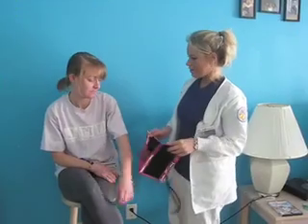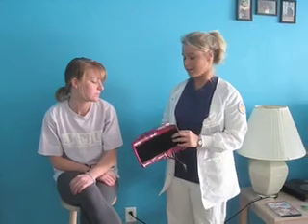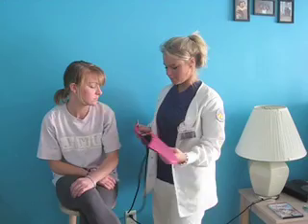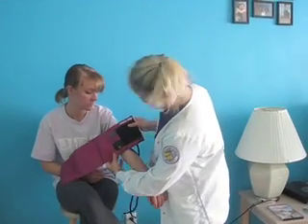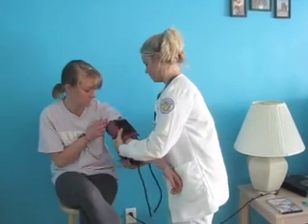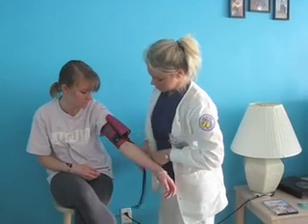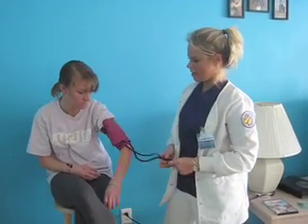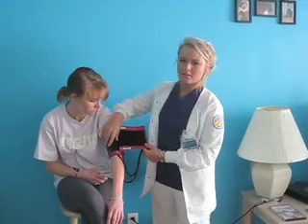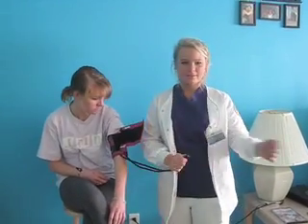Blood pressure. Hi, I'm here to take your blood pressure. Now before I take it, I just want to explain that it's rarely ever taken manually anymore. Now this is hooked up to a machine. So what I'm going to do is find where it says artery and put it near her brachial artery, which is located right here. Wrap this around. Now cuffs can come in many different sizes. There's small, medium, and large. To find the correct placement of the cuff, in between these two lines, it must wrap around and connect here. These things will be connected to the machine.